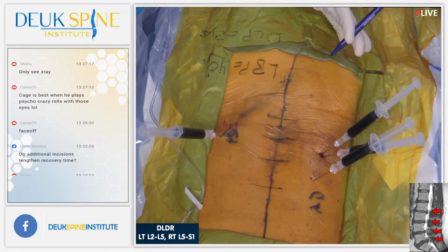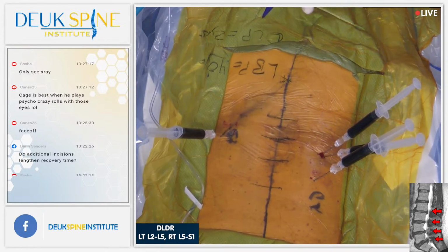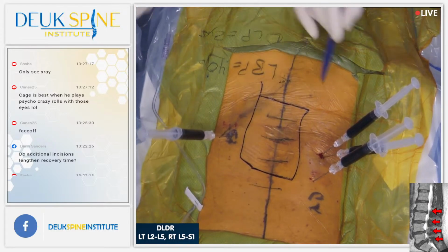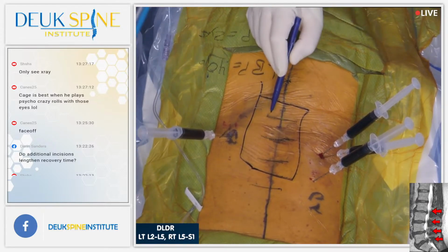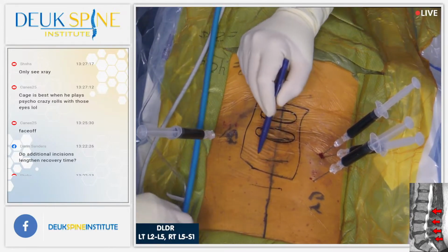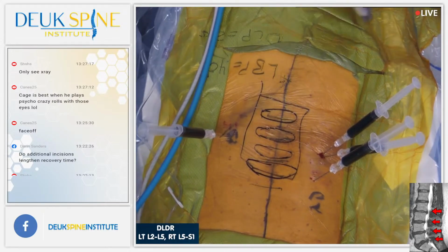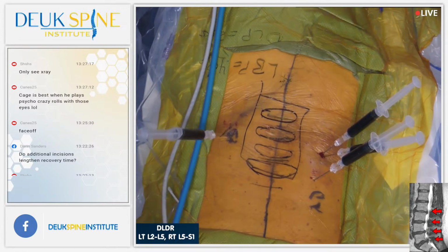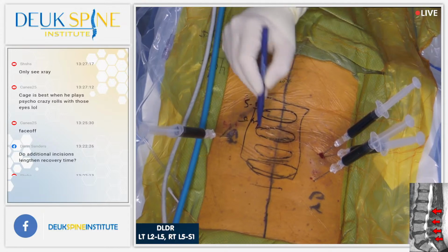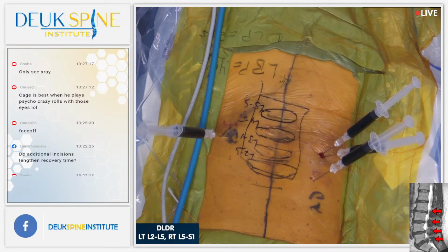All right. Is he awake? So we do need our patient awake. When I asked him where he has back pain, this is what he told me: this area right here. And in this area, he's really got 4 spots that on the MRI look to me like they could be causing his back pain, and then really 3 spots causing left leg pain. So we have the L5-S1 disc, L4-5, L3-4, and L2-3.